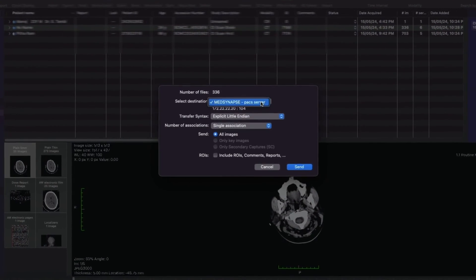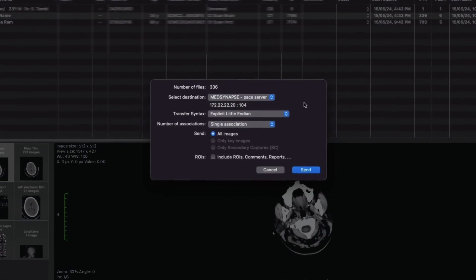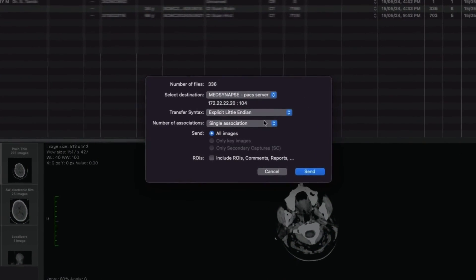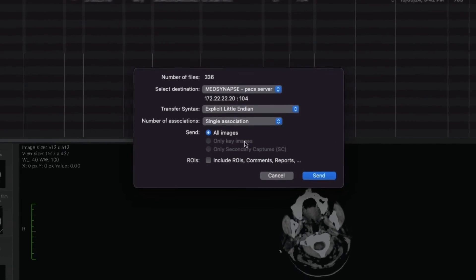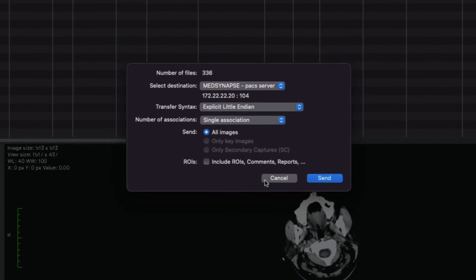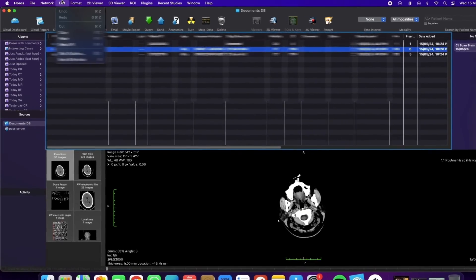You can also send downloaded images to another DICOM workstation by selecting the station name and clicking the Send button. Additionally, you can burn a CD directly from the software.